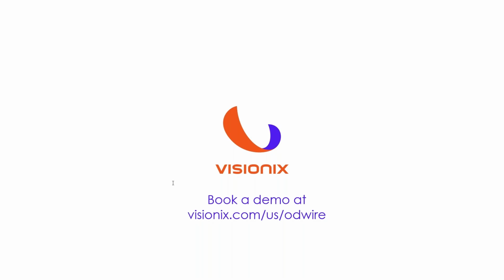And related to glaucoma, what are the best resources to learn the GCC norms on OCT? Well, that's going to depend on the technology, the device that you're using. I don't know a number to tell you. Each company has a normative database for their technology.